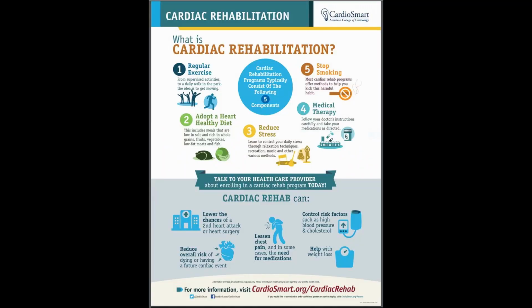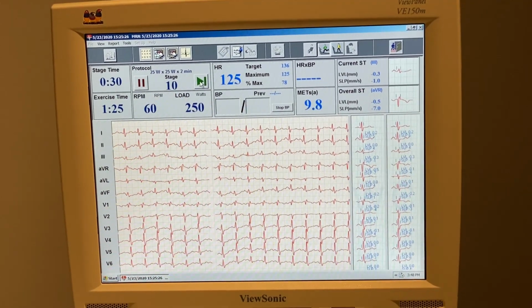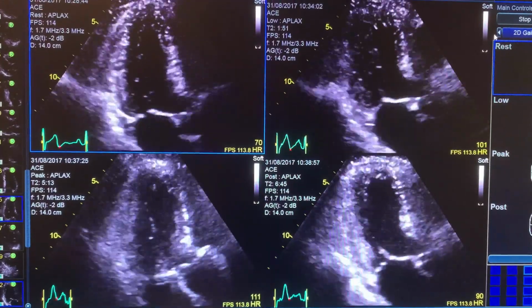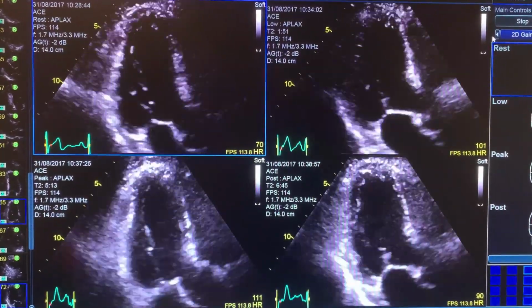It gives us a lot of information about diagnosis, prognosis, and treatment effects. It gives ECG data as well as echo or ultrasound picture data. It has much better accuracy compared to a treadmill stress ECG test, which is only where somebody's going to exercise with the ECG on. We don't just get ECG tracings, we also get the pictures using ultrasound.